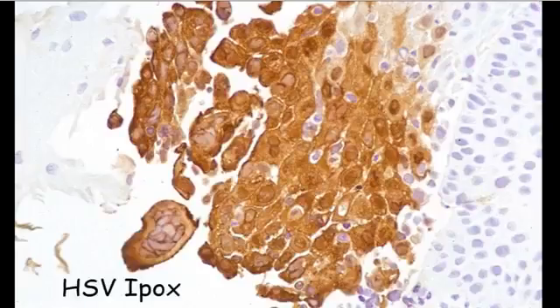If you're in doubt, there are plenty of good commercially available immunostains for herpes that you can do. Our lab has both HSV1 and HSV2. It's useless because every case I've ever had is cross-reacted and they're both positive. And I never know which one, and I don't think it really matters. But you could probably save money by just having one of those 2 antibodies.